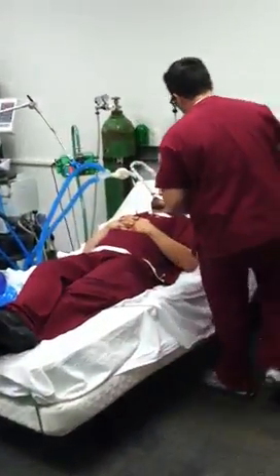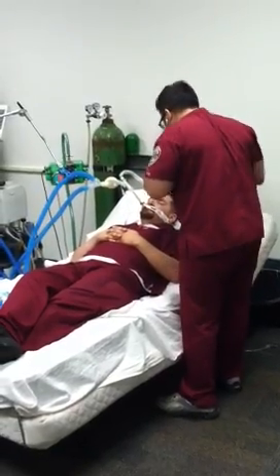He says to the patient: "My name is Art, I'm a respiratory therapist, and I'm going to change your circuit here, all right? Take a quick listen."